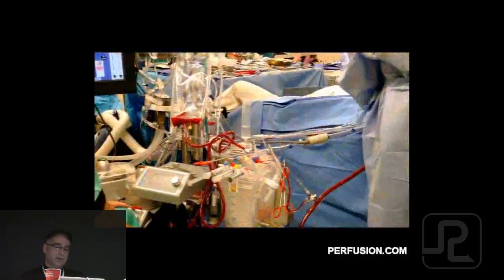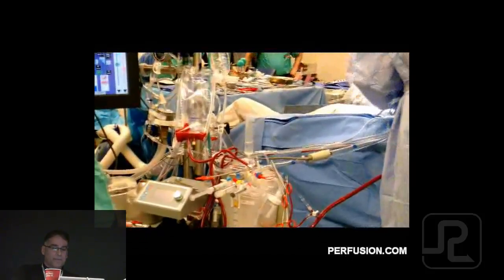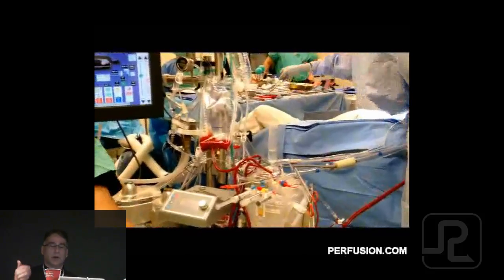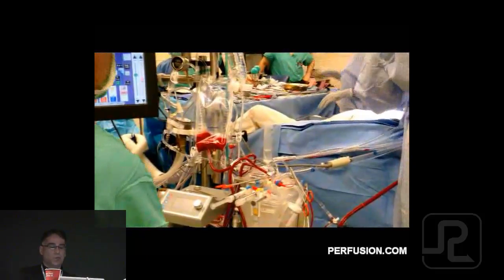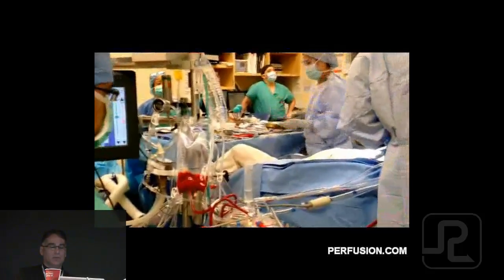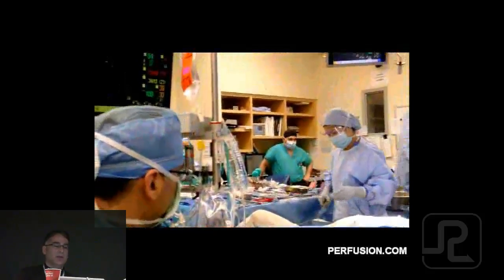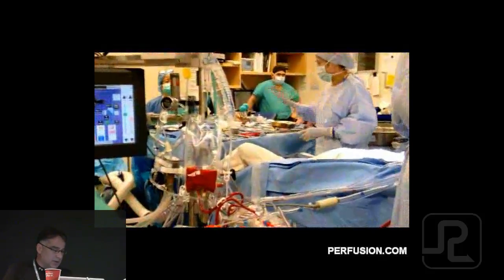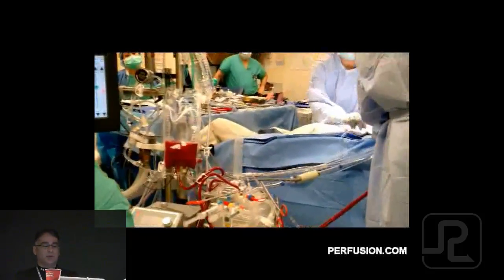The surgeon keeps telling me I can go on bypass when I'm ready. But we're communicating how much I have, what my goal is. My goal is a liter. See the pressure 122/50. And our anesthesia providers help us out, giving little doses of Neo to help bump up the pressure periodically.